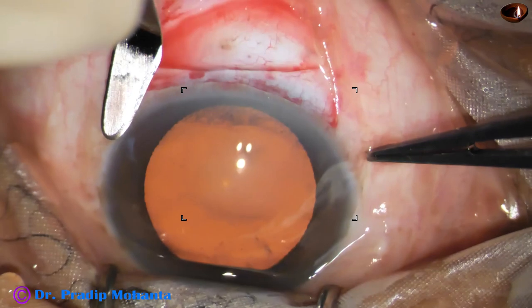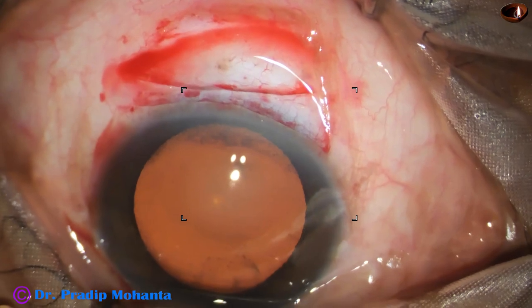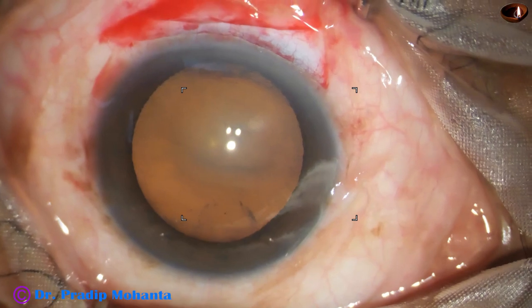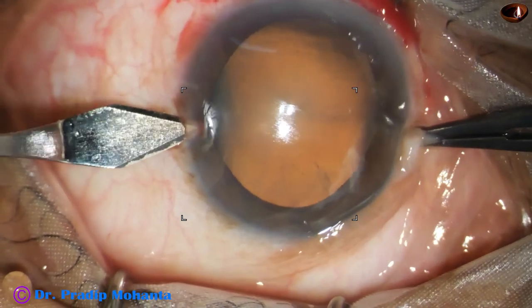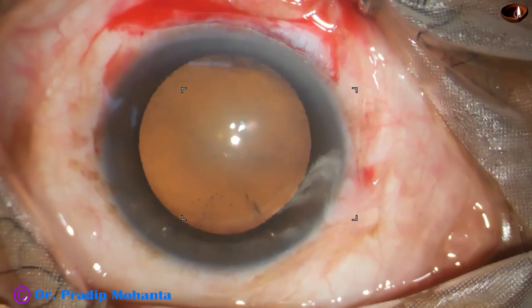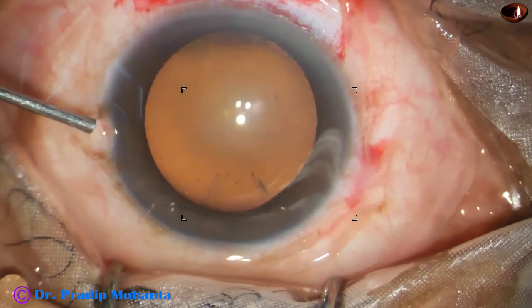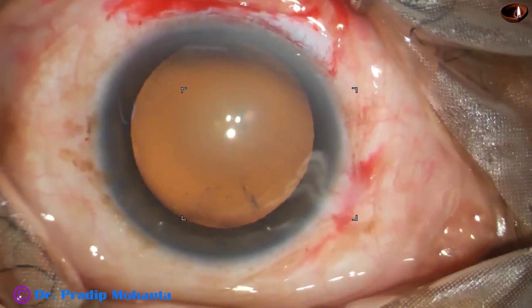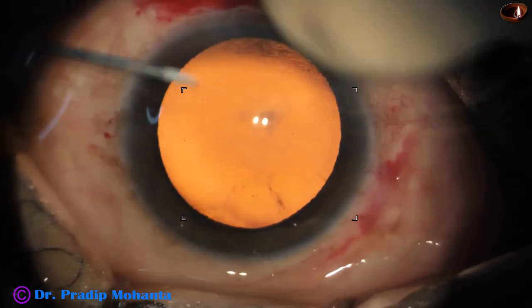This is a soft cataract so we do not need a larger incision. A side port is being made at 8:45 o'clock and we are having very good red glow. The microscope is Lumera T from Zeiss, Germany. The anterior chamber is filled with visco — this is the stereo coaxial illumination.